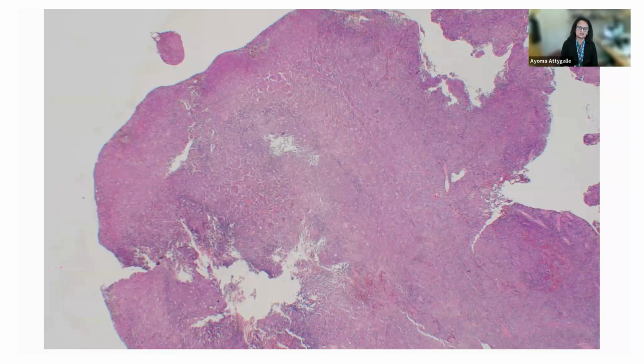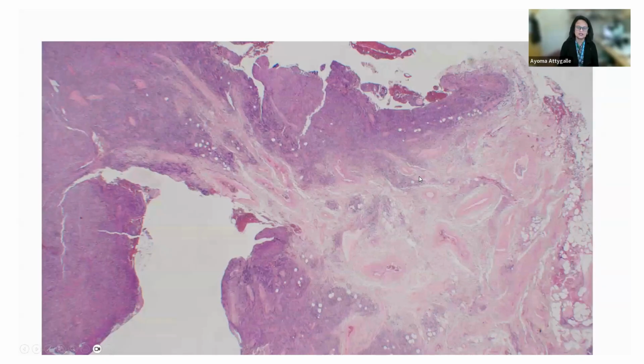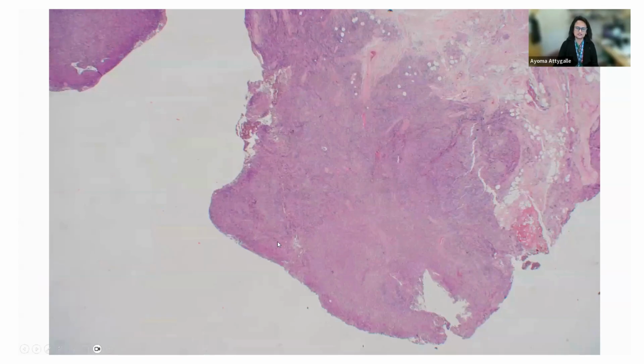But what you are noticing is that the architecture of this node seems to be partially altered. At least I can see there's a reactive lymph node here with a mantle zone, but there seems to be an expansion of the paracortex of this node. And the scarring, as I said, is not something that is unusual, and this has caused some distortion to the node as well. In an area of the node like this, which is quite a fragmented node, you're seeing effacement of architecture. There seems to be some sort of follicular structure here, but otherwise it's markedly expanded paracortex, almost pushing the follicle to the periphery.